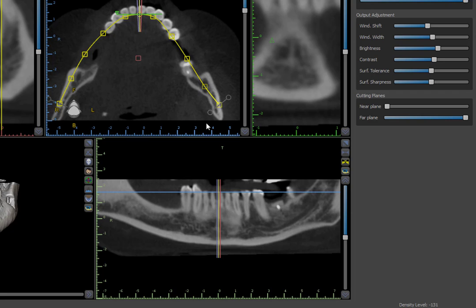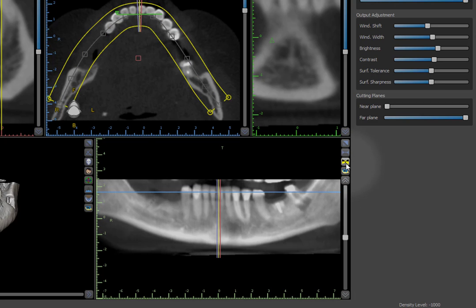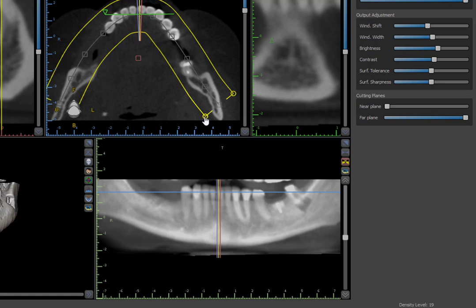Observe the panoramic in slice mode where the pano curve was adjusted to show the canal. In composite view, the panoramic curve in the axial view displays as a double-line curve, which are the inner and outer limits of the image shown in the pano. Left-drag on any of the four control circles to widen or narrow the pano field of view. Observe how the panoramic image changes depending on the width of the pano composite curve position.